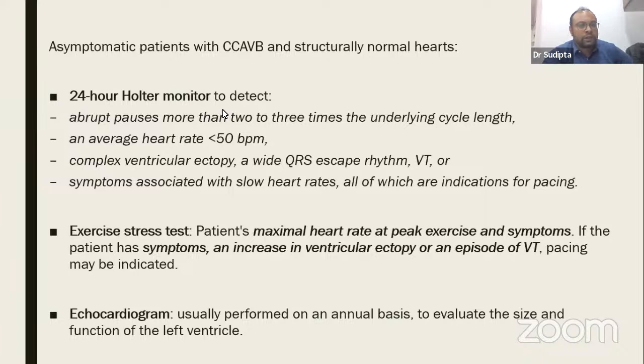24-hour Holter monitor to detect some abnormalities, such as abnormal pauses, the average heart rate, complex ventricular ectopy, or a wide QRS escape rhythm, or ventricular tachycardia. They can undergo an exercise stress test, which might uncover symptoms or an increase in ventricular ectopy or an episode of VT, and an ECHO, which is indicated to see the cardiac structure and function.